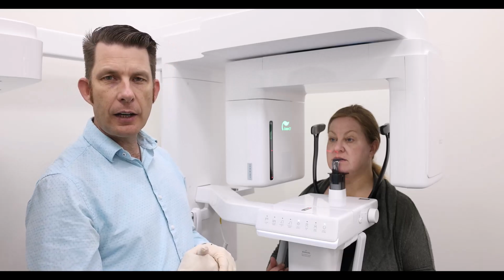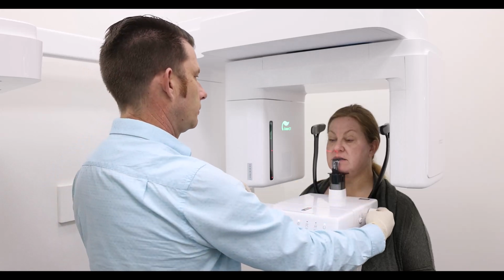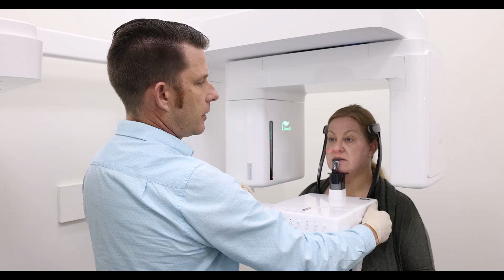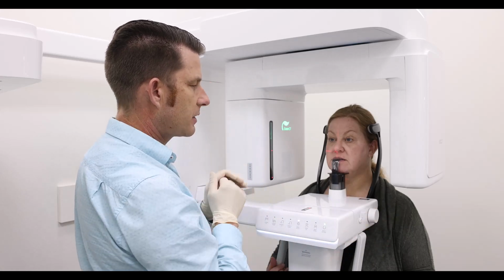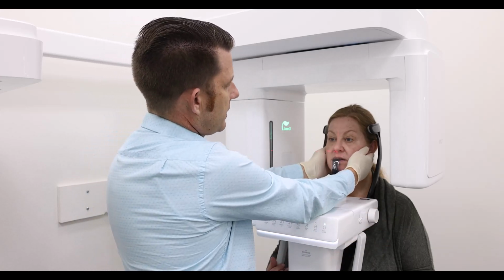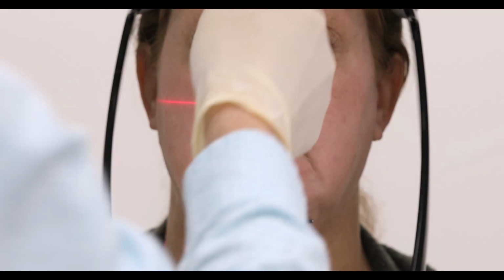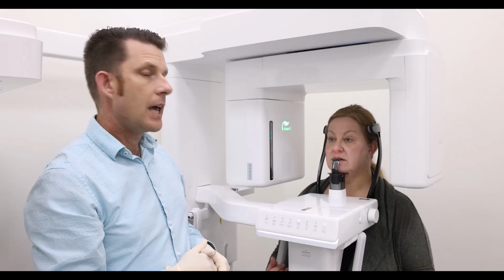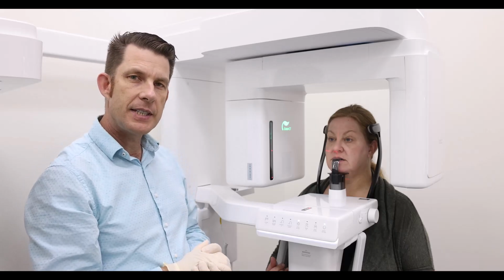Next, I'm going to go ahead and close my temple supports. And I want to make sure this is tight, so I turn it a couple extra times to ensure that the patient does not move. I'm going to adjust our patient's head a little bit to make sure they're lined up center. Mid-sagittal beam right between the eyes and right through the philtrum. And now we are ready to capture our CBCT.